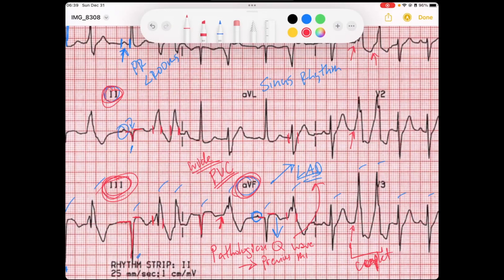In the setting of these pathological Q waves, I would love to compare them to previous EKGs, because this person might be completing their infarction.